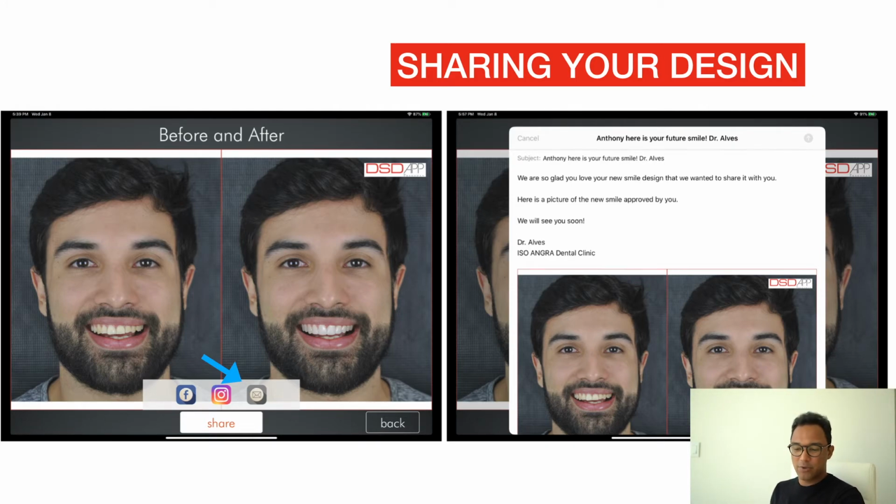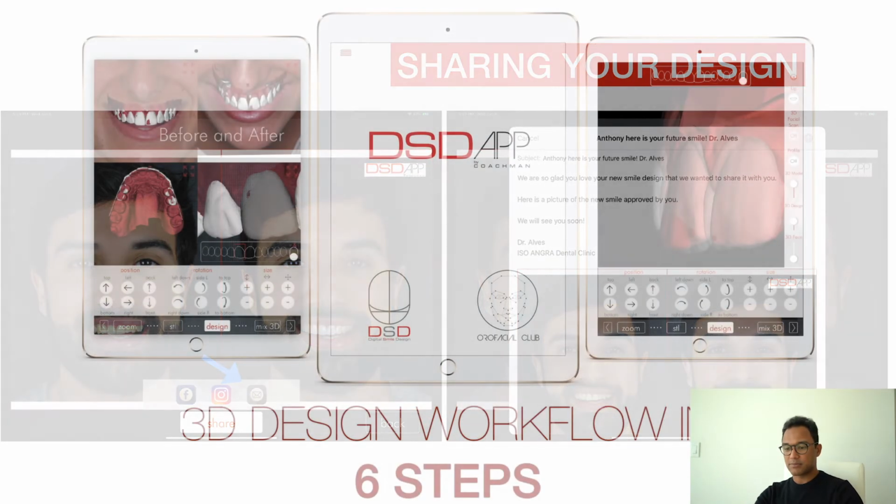That's a very nice way to engage your patient and to make them understand that you are there to create the most beautiful harmonic smiles. And the greatest thing is that he knows exactly how he will look right after the final treatment.